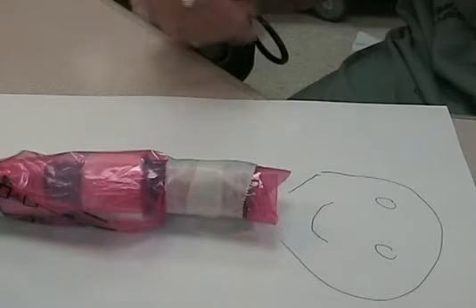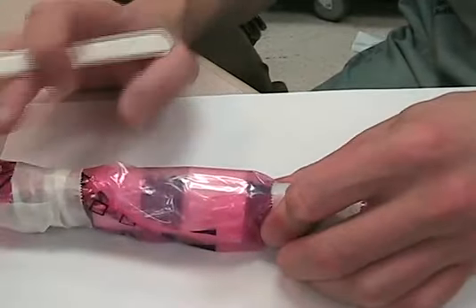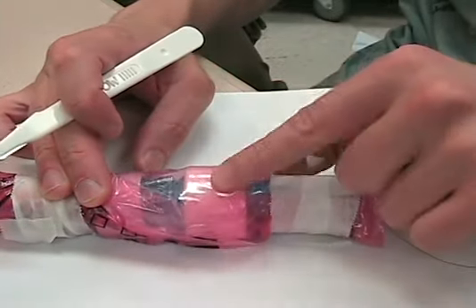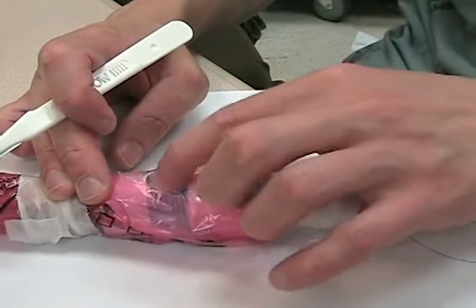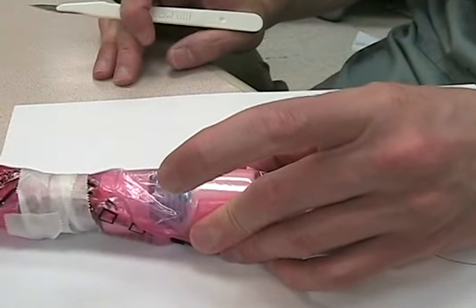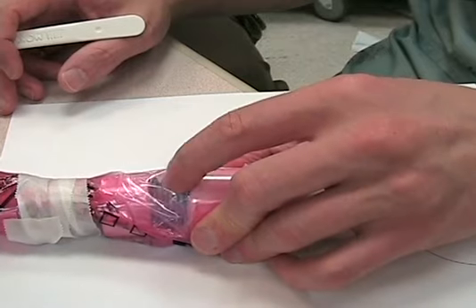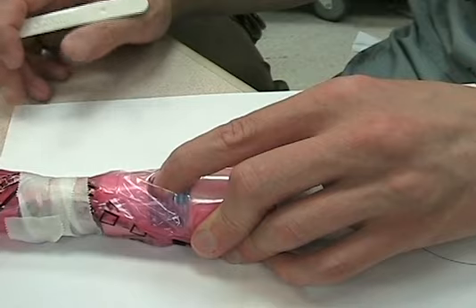Step one: you're going to find your cricoid — the little one down here — and your thyroid, the big one. We're using the clear skin just for didactic purposes, but otherwise it's all by feel. This is your Adam's apple up here, the cricoid cartilage down here, and the cricothyroid membrane in between them. With your non-dominant hand, grip the thyroid between your middle finger and thumb — get a nice tight grip and don't let go no matter what. With your index finger through the skin, palpate the cricothyroid membrane.